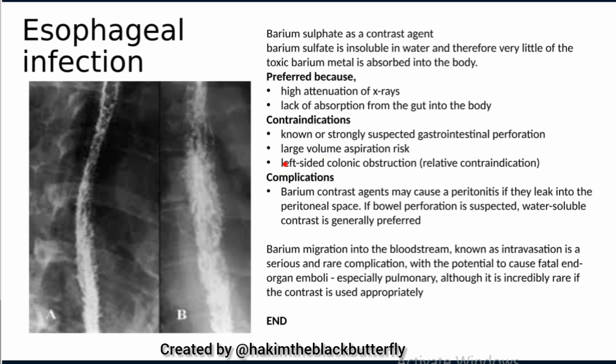Another contraindication is if a patient has left-sided colonic obstruction. Remember this barium sulfate is metallic. So when there's an obstruction, we shall see that this barium sulfate will solidify, and it will complicate the constipation, like the patient will have some bad constipation. So we have to make sure that we ask this patient if they have any of these risk factors, which we don't want the patient to have before doing the examination.